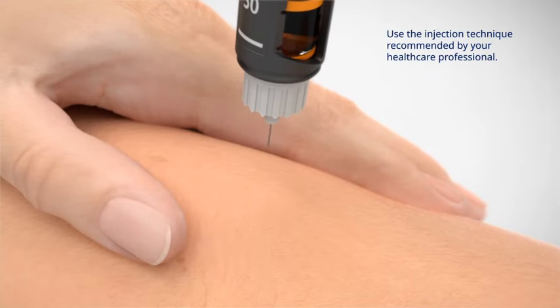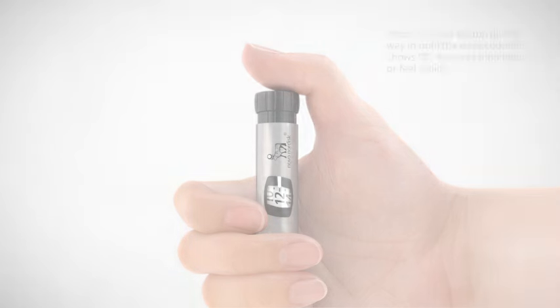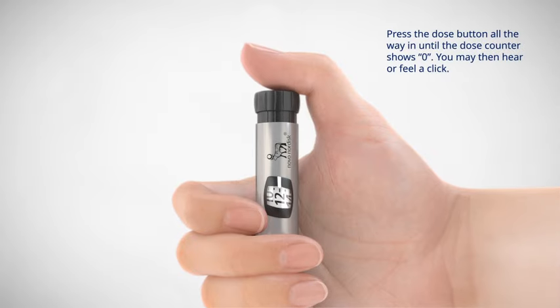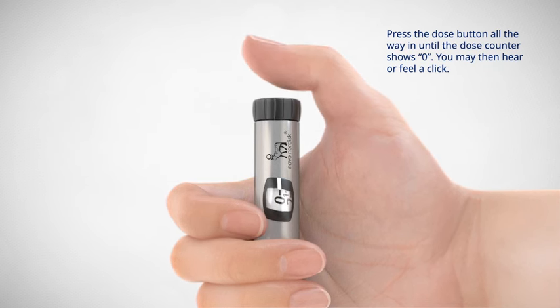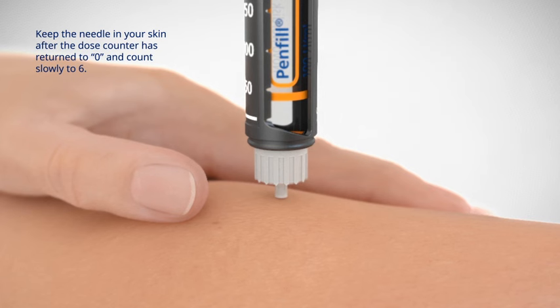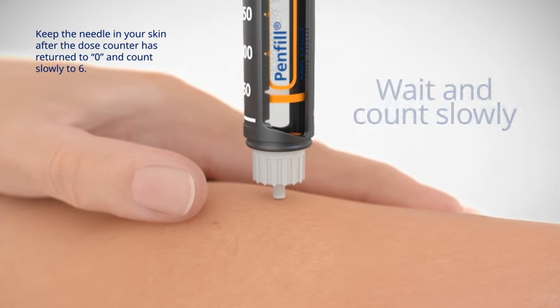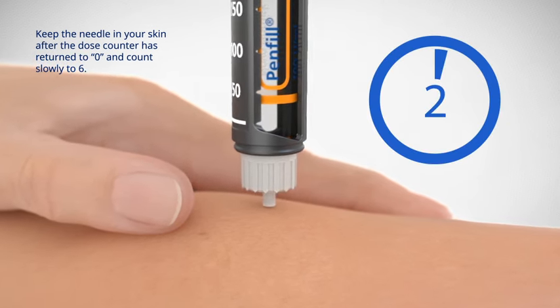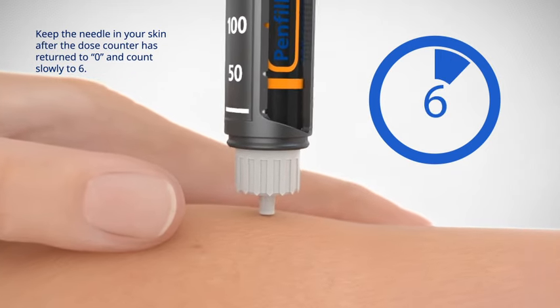To inject the dose, lift a skin fold, insert the needle into your skin, and press the dose button all the way in until the dose counter shows 0. You may then hear or feel a click. Keep the needle in your skin after the dose counter has returned to 0 and count slowly to 6. This ensures you get your full dose. Wait and count slowly. 1, 2, 3, 4, 5, 6.